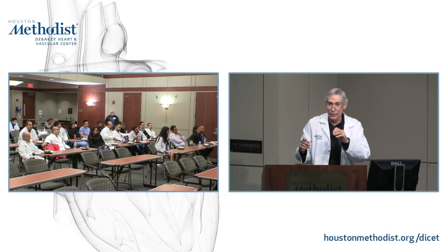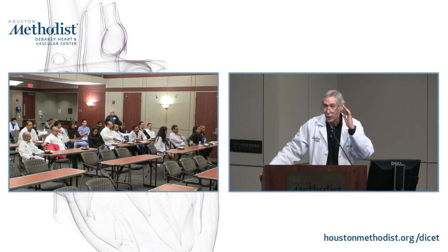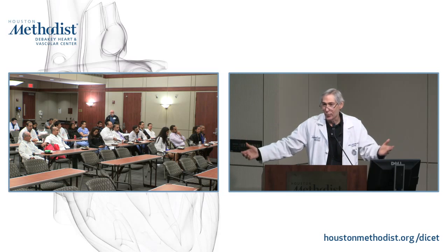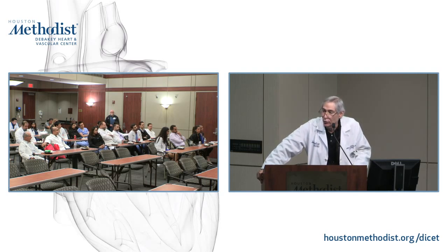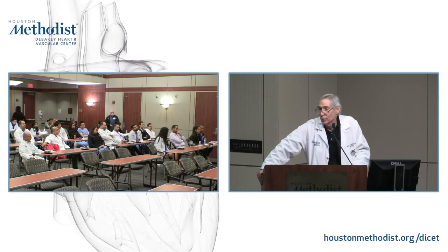When I first met with GE about this, they said you are going to try to get people in because of an abnormal CT, an abnormal treadmill test, or an abnormal stress echo. And I said yes, those are the people we really want to get in. We don't want to put them in because they have an abnormal perfusion scan, because that's what we're testing, the perfusion results. We don't want to bias it that way. So that's probably another reason why the specificity was the way it was in the first pivotal trial. Make sense? Again, that's speculation, but it makes sense from a clinical trialist point of view.